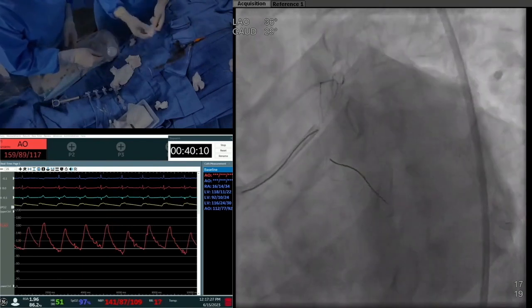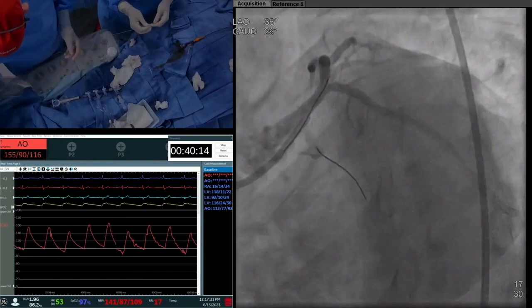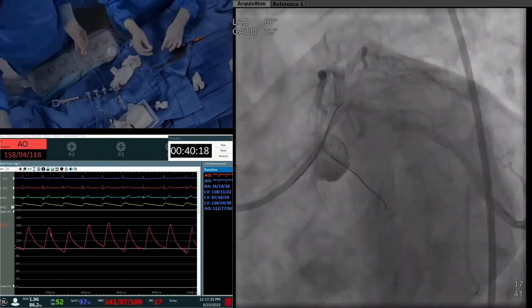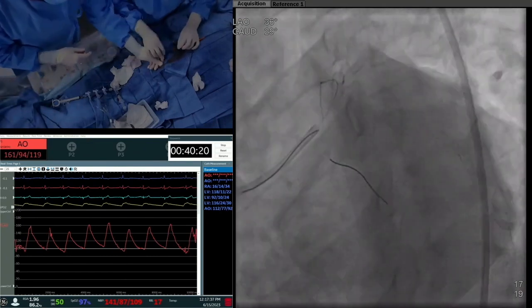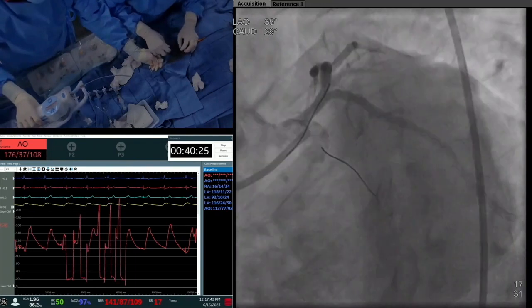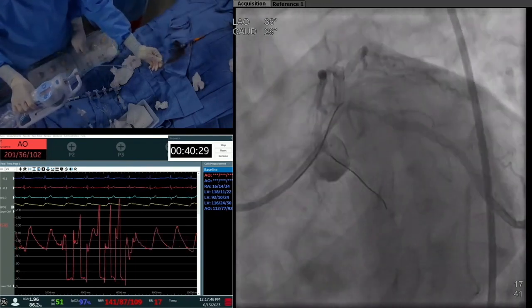Yes, we're going to do that. But I think let's finish the image. We have a job to make sure that everybody is happy, so she's going to finish the job of the diagonal first. All you have is two wires, that's what she's doing. You can see angiographically there's obviously a constricted area of the ostium of the main branch. Can you show us the fluoro so we could see how she crosses the diagonal, please? Instead of cine? Okay.